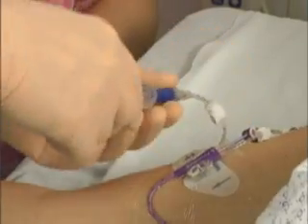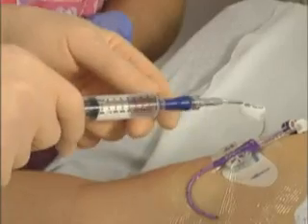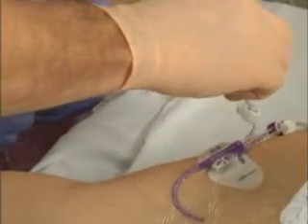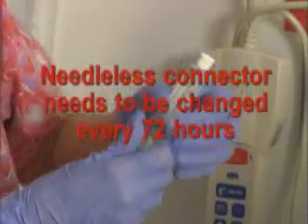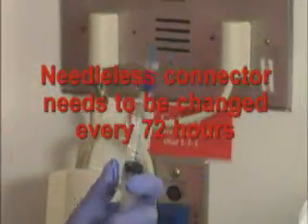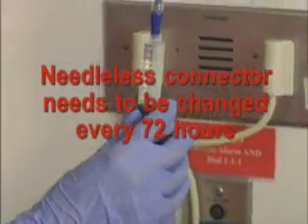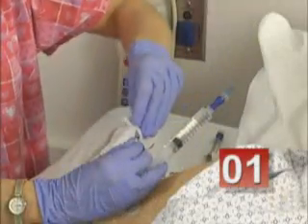Remember to open the clamps. And no, I can't get a blood return either, so I think we need to change the needleless connector first. I have one. You should change the needleless connector every 72 hours, routinely. Okay. If you're doing transfusions or frequent blood draws, you might want to change it more frequently, but preferably not more than once every 24 hours. Okay. We want to keep a closed system as much as possible.